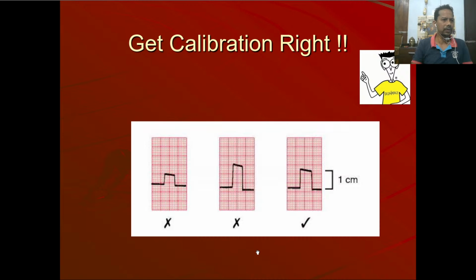But our fundas about ECG, how to take the ECG and how to record the ECG, have to be right. One sec please. Okay, now get the calibration right. This is the most important message for today.